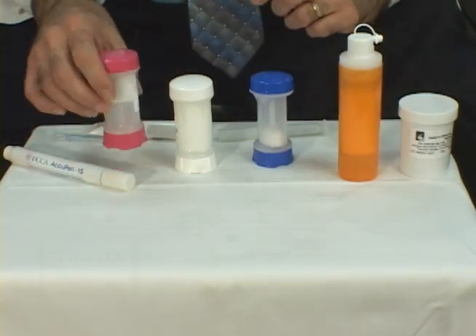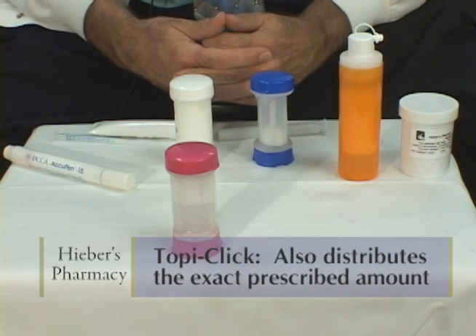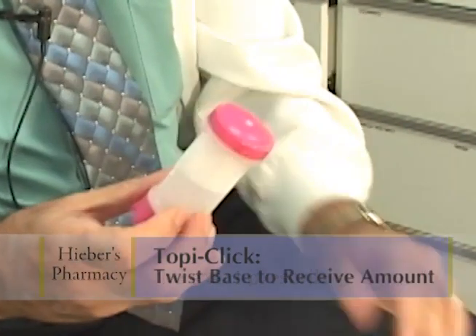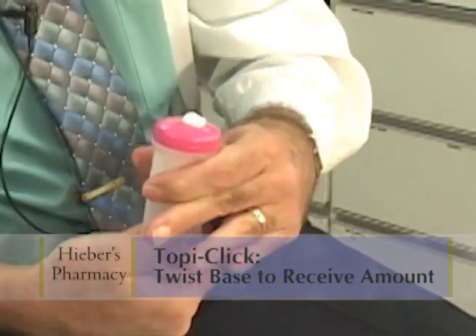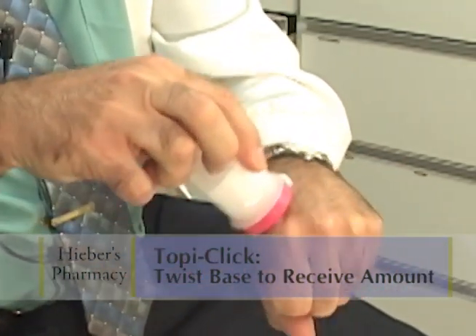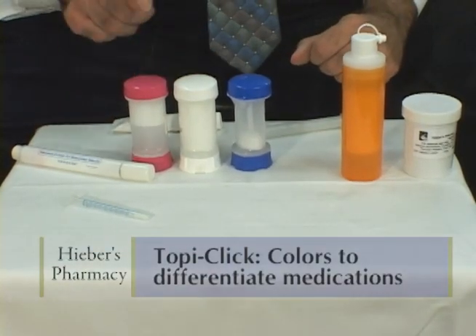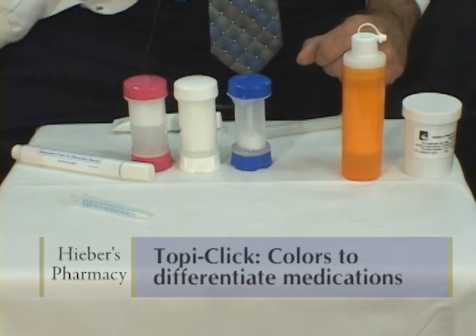Another one that we use is the Toppy Click, and it's a similar principle, but instead of pumping you just twist the base one, two, three or four times and it gives a pre-measured amount of the cream, ointment or gel that's applied to the skin and rubbed in. We have different colored Toppy Clicks so that we can differentiate between different medications — pink, blue or white.